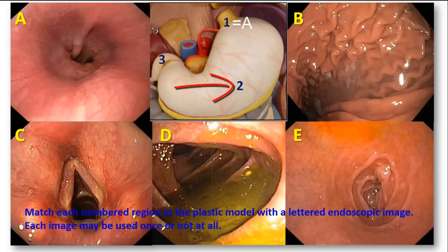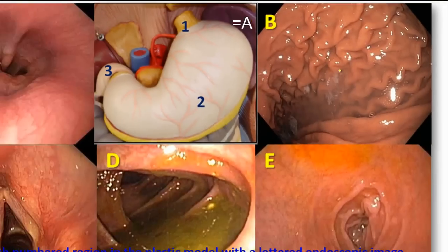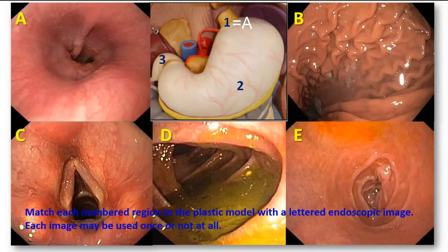2 indicates the body of the stomach, and if we look at B, we will find that it also conforms with the body of the stomach, because here we can see that there is a mucosa which has longitudinal folds. These are the rugae of the stomach — the longitudinal folds — that increase the surface area and allow for the distention of the stomach. This is a very characteristic feature of the stomach. So 2 matches with B.